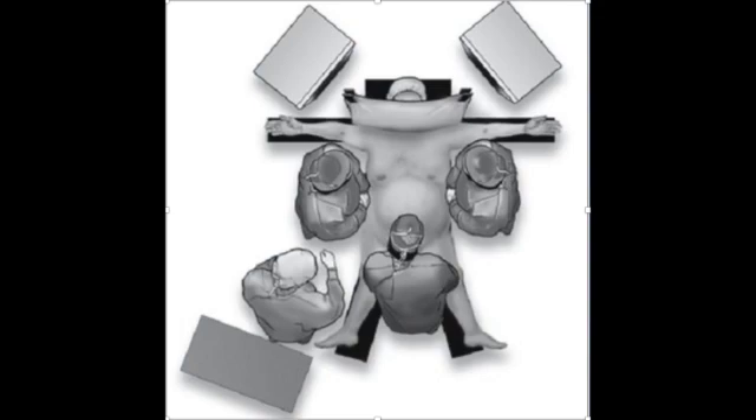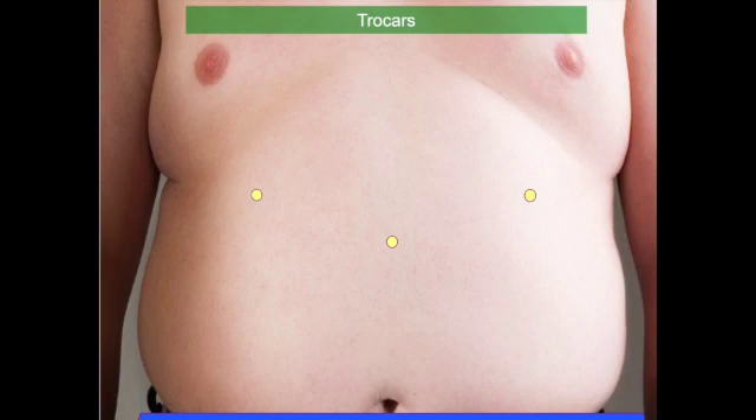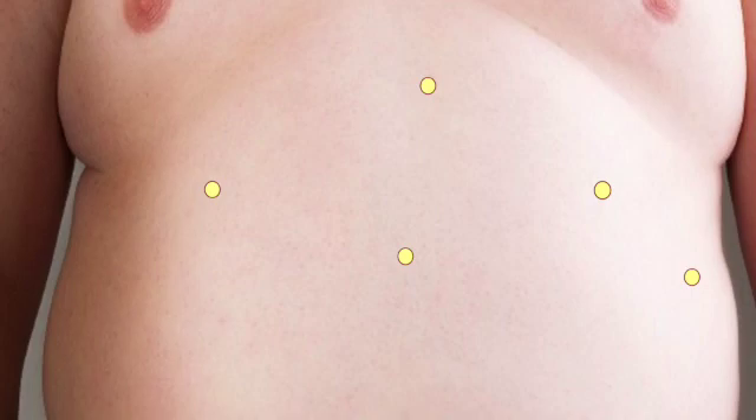We start by doing the pneumoperitoneum by inserting the needle in Palmer's point and inserting a 5mm trocar for the 5mm camera. We are very liberal with 5mm trocars because they don't leave visible scars. We put two additional 5mm trocars on both sides while the surgeon works on the top of the abdomen — one below the xiphoid for the liver retractor, and an additional 5mm in the lateral left flank for the assistant.